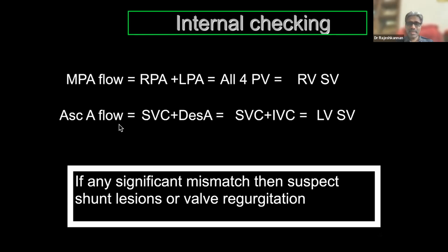If there is any mismatch when you are doing the PC, then you have to suspect either a valve regurgitation, or shunt lesions like septal defects, a PDA, or any collaterals.